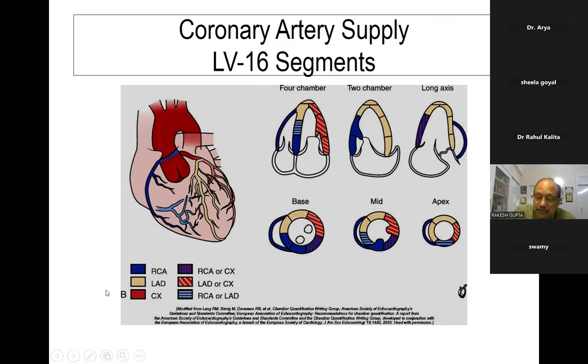I can't see the two-chamber view. Man, it's very difficult to make two-chamber views. Even today, I joined doing echo in 86, 14 plus 25, 39 years, and still I struggle for making two-dimensional or two-chamber views. But the two-chamber view has a papillary muscle. The three-chamber view does not have a papillary muscle.